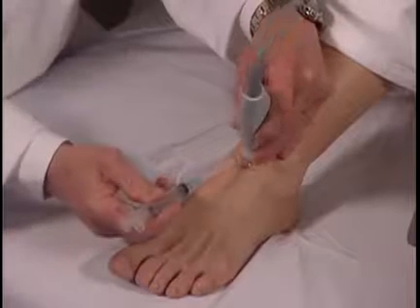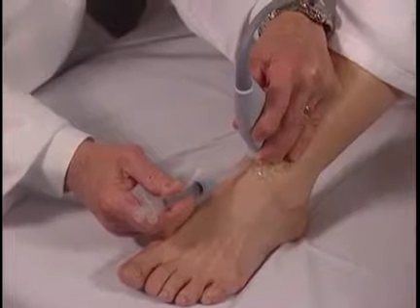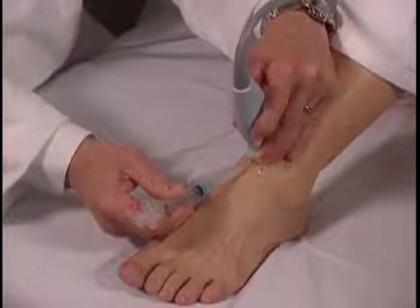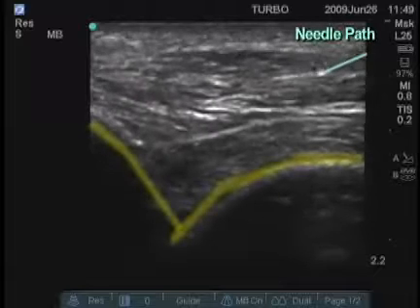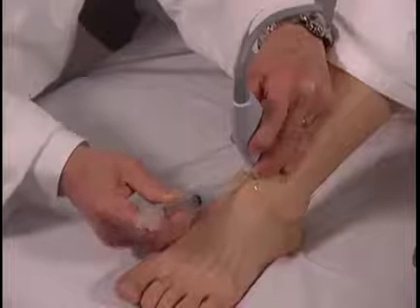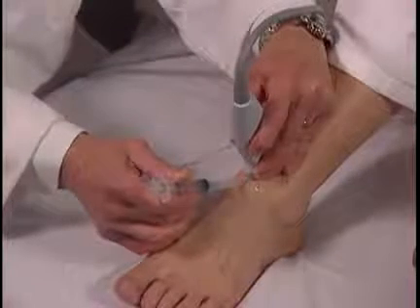It would be very important to move either medially or laterally to avoid that artery. So I would move this over a little medially, then enter here relatively close to the transducer edge, going in at an angle sufficient to get down to the depth where the effusion is. This joint is approximately one and a half centimeters deep, so I'll have to angle the syringe such that the tip of the needle goes to a depth of two centimeters.